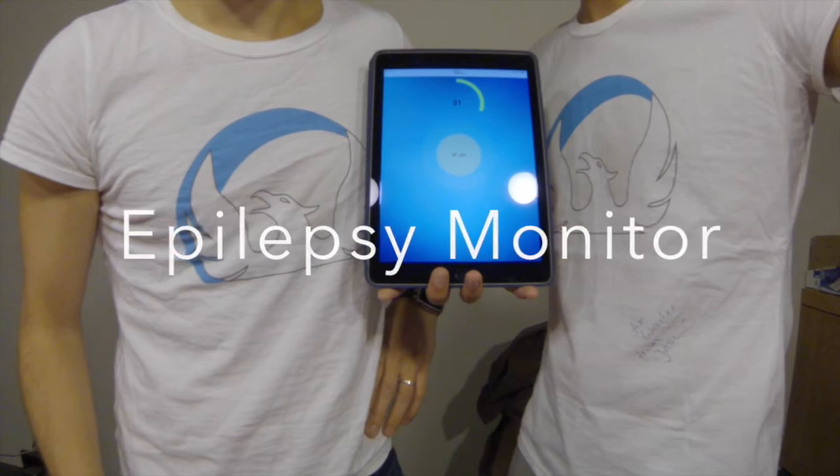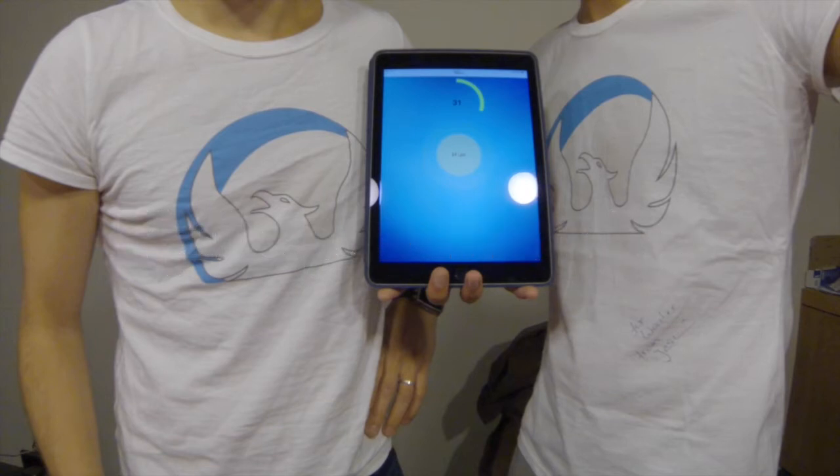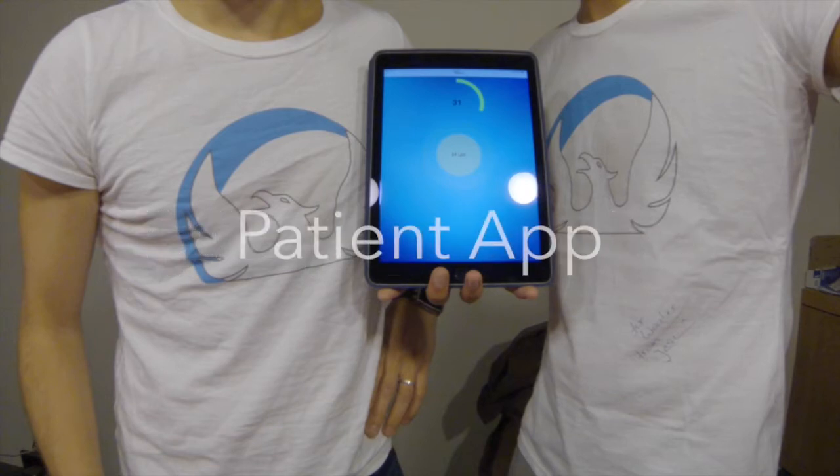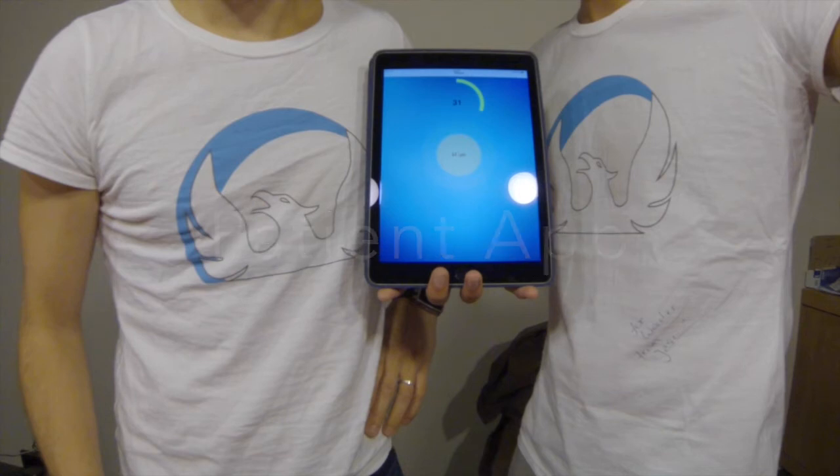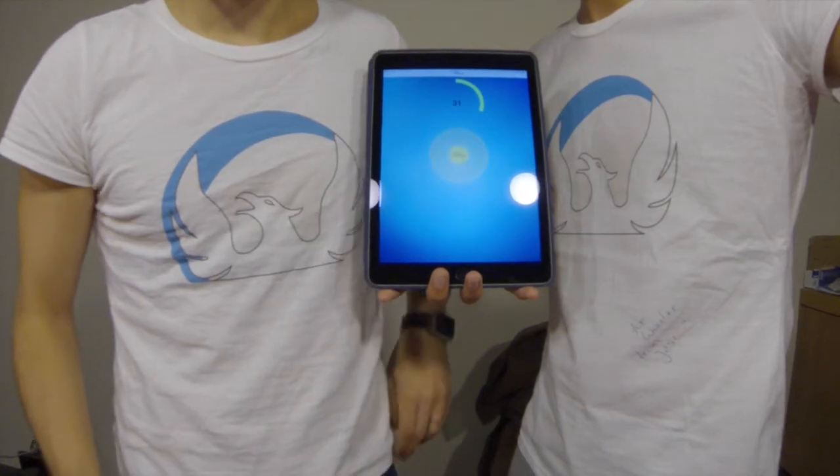Hi, in this video we will show you our epilepsy monitor system. We will start with the application of the patient.